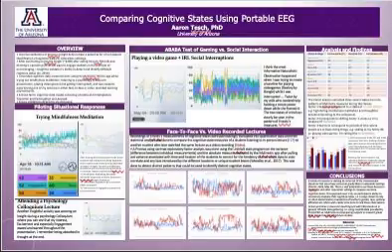And then I had a student do an internship with me, or an independent study, where they took the graphical data that my Emotiv has as an output and turned that into quantitative data that could then be statistically analyzed later.